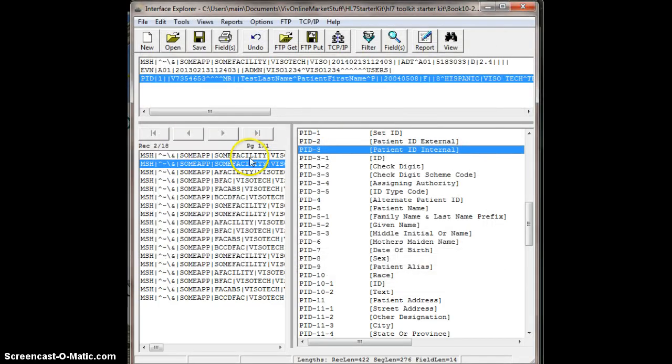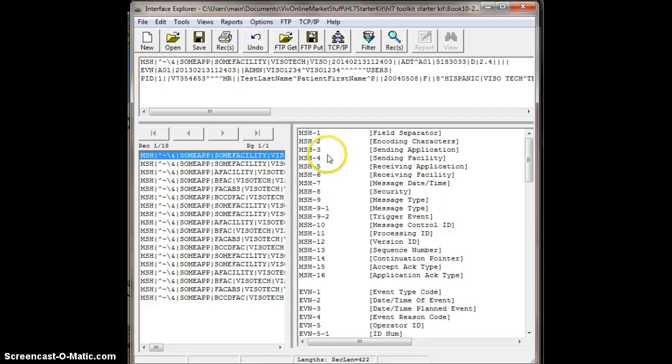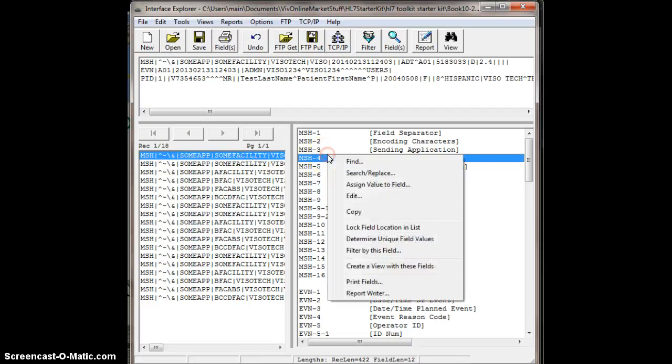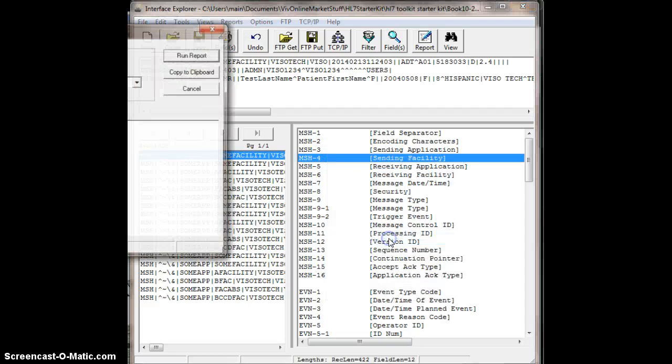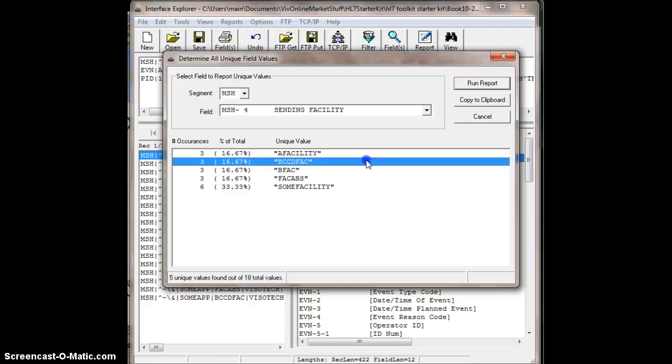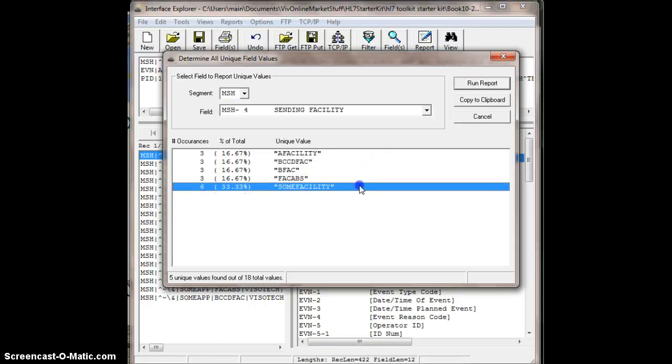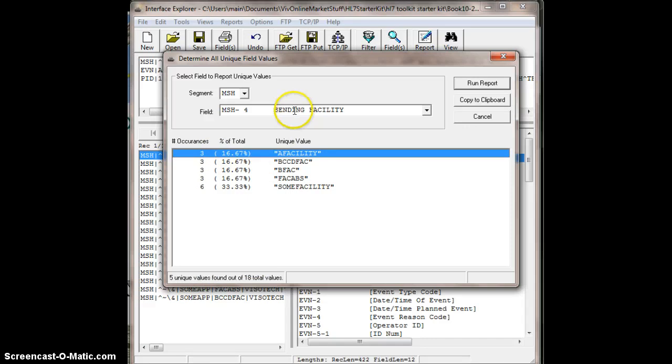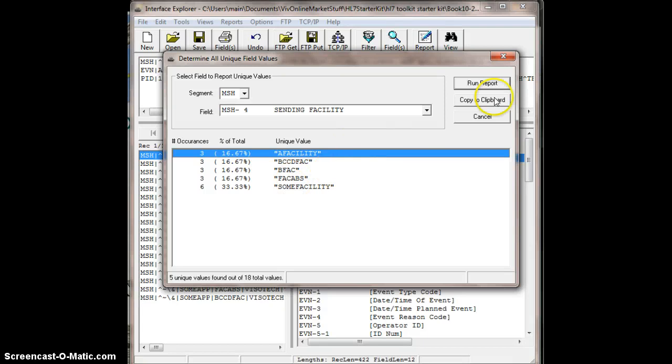Let's say you want to do MSH4, because I know that's different because I did that with the other video. Determine unique values. Here you get a list of all MSH4s. You know there are five unique values, so MSH4 is sending facility, and I have five unique sending facilities in this entire list of HL7 messages. And that becomes very useful when you're analyzing information.